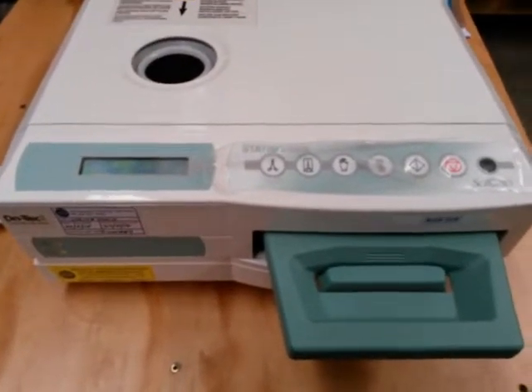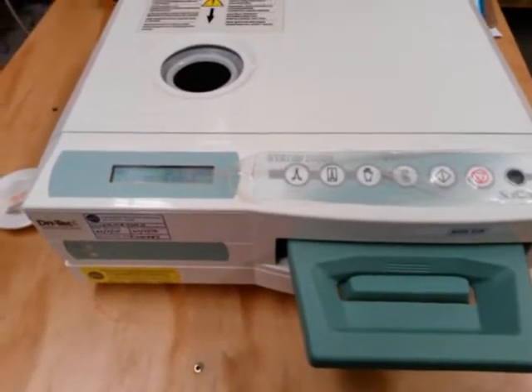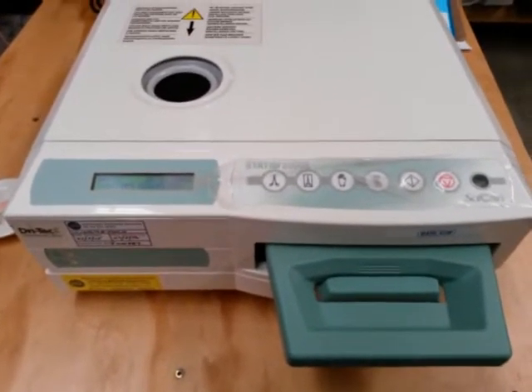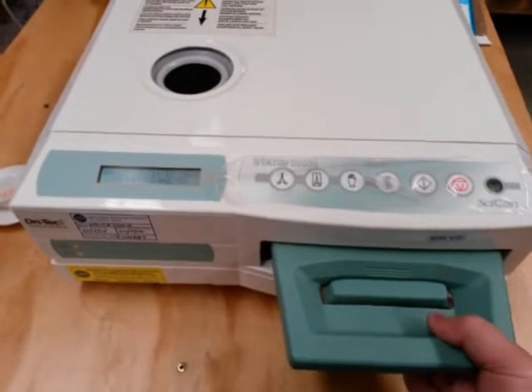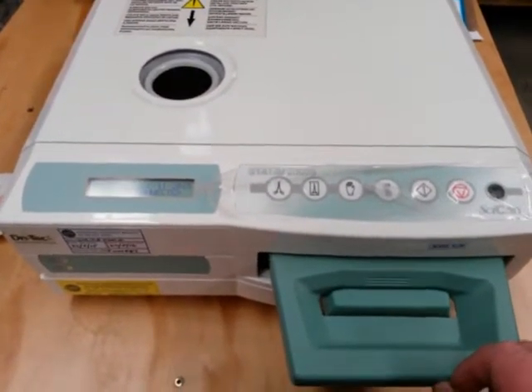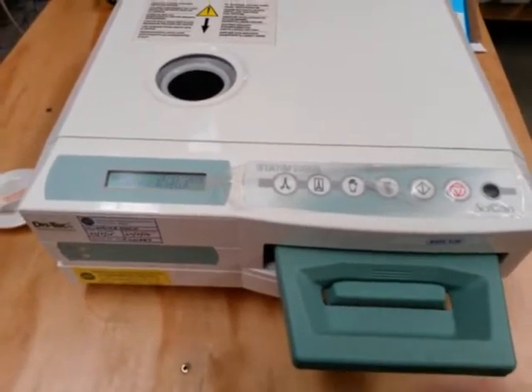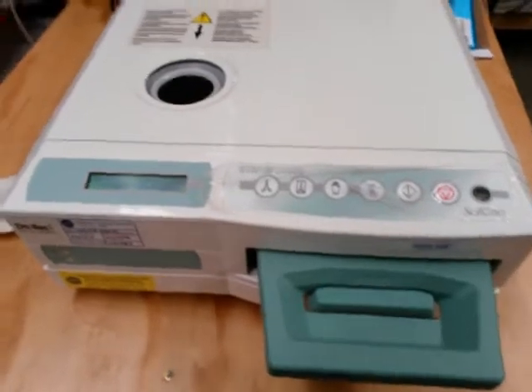We've got a Statim that's just come into the workshop for repair, fault unknown at this stage. The first thing we always check with the Statims is with the cassettes — as you push them in you should actually hear the solenoid click. In this instance I'm not hearing a solenoid click.